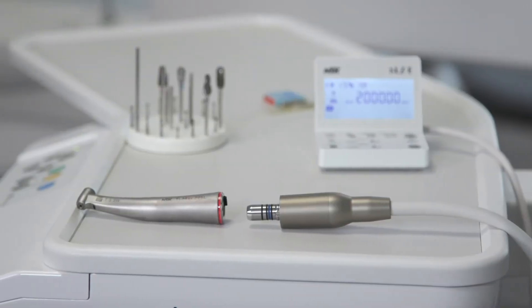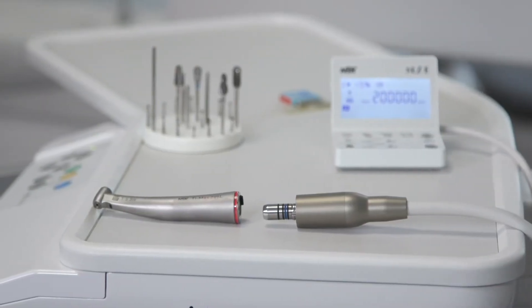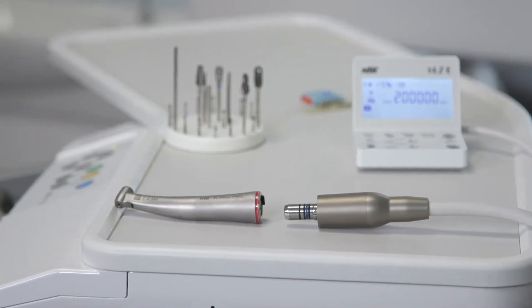Hi, I'm Gina from NSK. I'm going to give you an introduction to the NSK red band handpiece and electric micromotor. I'll run you through how a red band works, how it can be used in place of an air turbine, and using your red band with your electric micromotor.